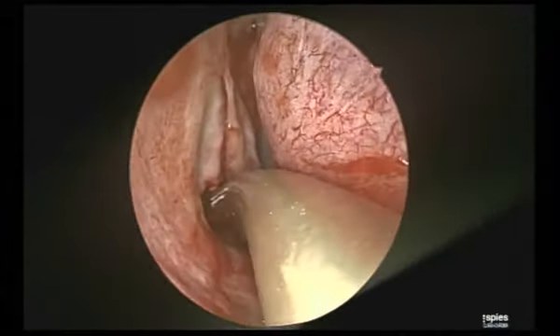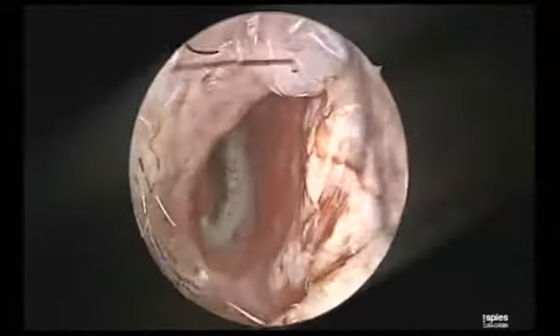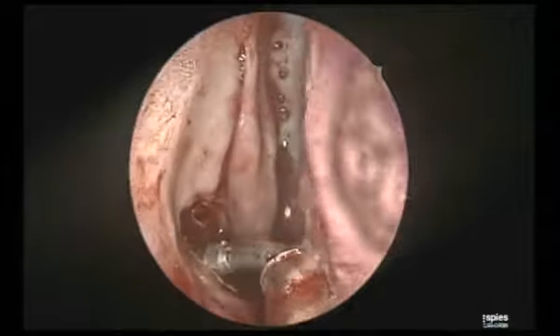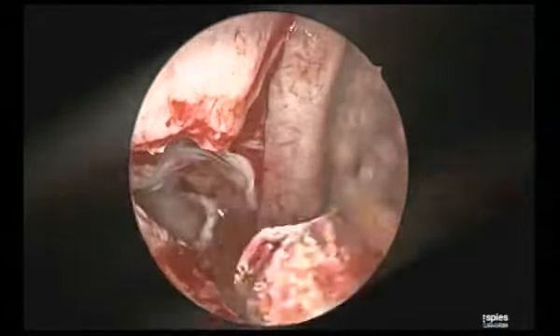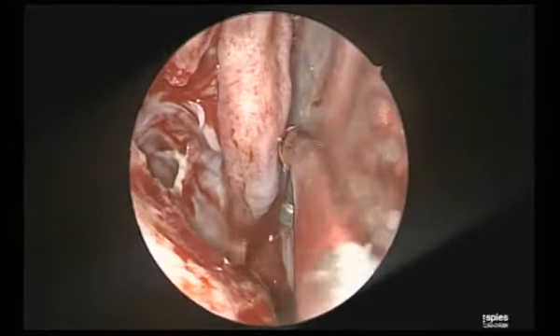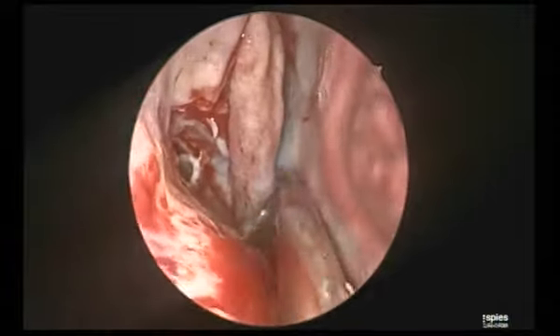Section लगा. Infiltration करायचंच नाही. Just paint the walls with adrenaline. Ashish, do you find any need of infiltration in surgery after seeing this kind of field? Not at all. And for this benign situation, the injection is rejected now. Don't worry.